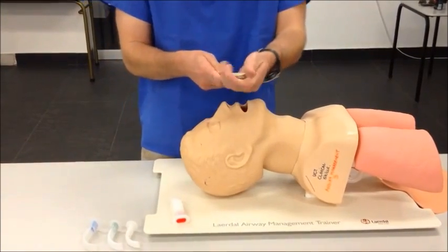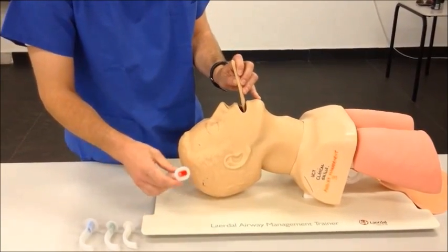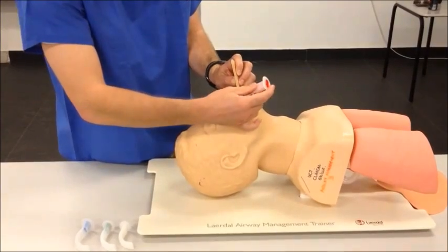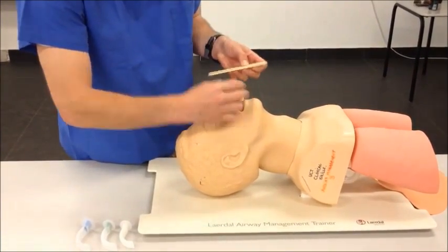Hold the tongue spatulas together and use them to gently displace the tongue anteriorly while you slide the OP airway into the mouth.